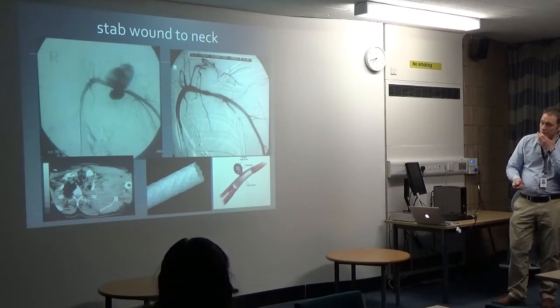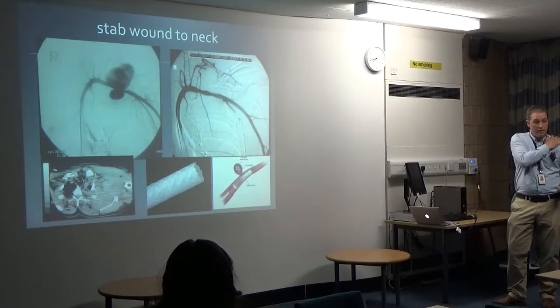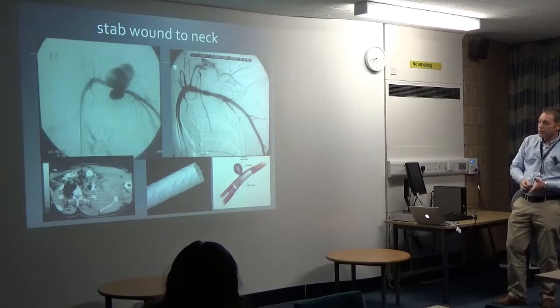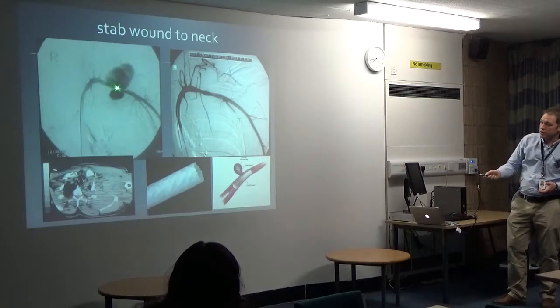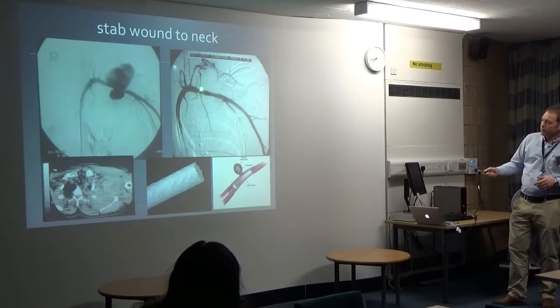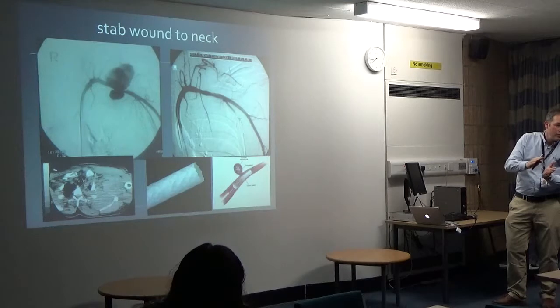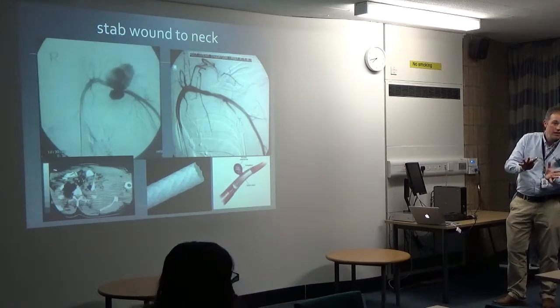So this is just an example of us mending an artery that's broken. This is a CT showing somebody has been stabbed in their shoulder area. They're bleeding lots and lots. We've done an angiogram that shows all this. This big blob here is just blood escaping from the artery while we're taking the picture. So this patient's bleeding very rapidly. And we can just put a little needle, a little wire past this area of damaged, ripped blood vessel and put a little stent that just holds open this area and kind of relines the blood vessel from the inside, stops the bleeding straight away.